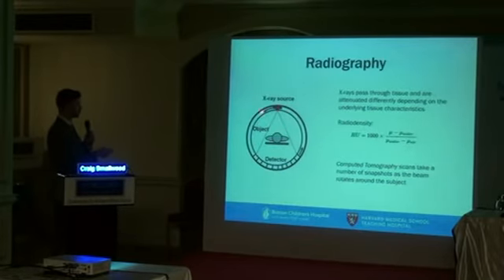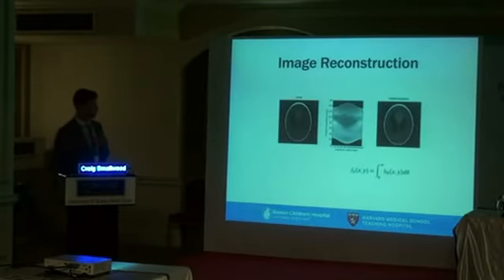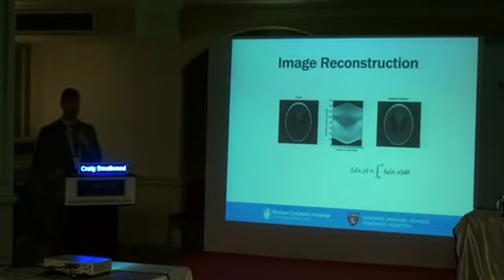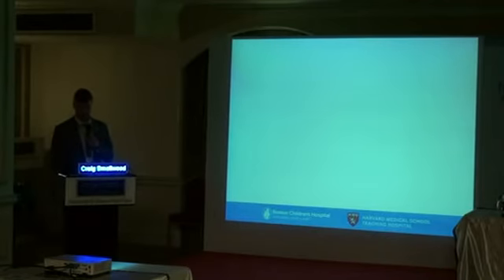You probably do this more often than I do, and then it'll take a bunch of X-rays simultaneously, circumferentially around this and just rotate. And then what it does basically is the little scanner puts the X-rays through here. This is like basically a potato, right? And you get a one-dimensional image of what the attenuation of that X-ray is, and then you put that all together, and you get this nice little image. And there's a lot of beautiful mathematical processes by which those things are derived, but that's the general process. So you take a bunch of one-dimensional images, you put all those together, and then you can get a two-dimensional image of the distribution of ventilation if you're imaging the lungs with CT.